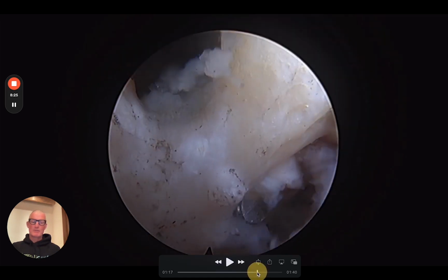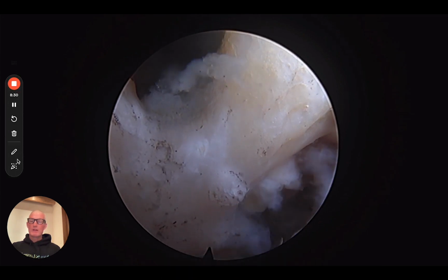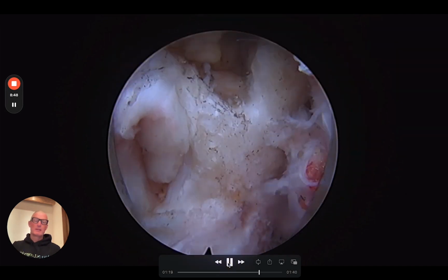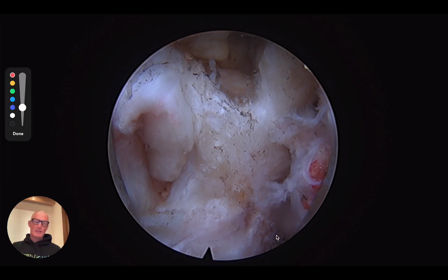Let's back up and look at that one more time, because this is a critical part of the anatomy. If I hit pause here, previously the area where we divided the nerve was down here, and now I've reoriented the camera. You can see the fibro-osseous tunnel that the nerve was traveling underneath, and I'm using a retractable ball tip nerve hook in a retrograde fashion to demonstrate the tunnel created by the mammillo-accessory ligament where the nerve travels. A pulled back view here illustrates the top of the transverse process, bottom of the transverse process, mammillo-accessory ligament here, and the previous trajectory of the nerve located like this.